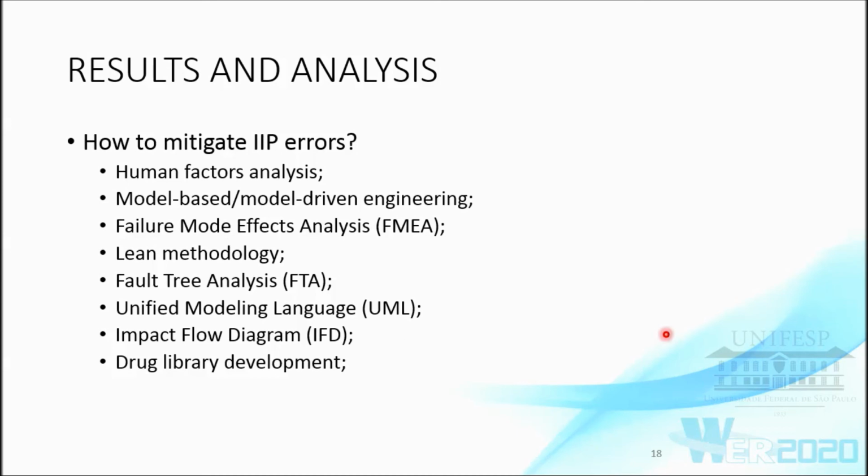The impact flow diagram that may be used to define a failure path for the use of technology, and the drug library development that seeks to introduce thresholds for the drug dosage, that is soft limits and hard limits. On the soft limits, an alarm must be emitted, but the user may overwrite and proceed with the infusion. But with the hard limits, the user must select another dosage, as those cannot get overwritten.